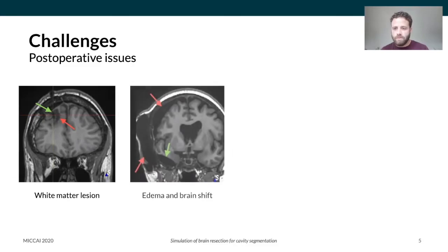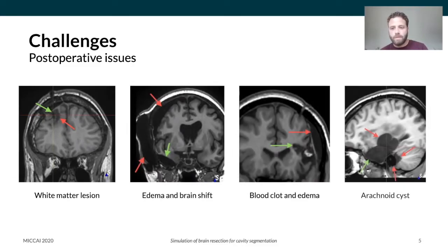Cavity segmentation is a difficult problem due to the variability in shape and texture of the cavities and to the different postoperative phenomena that make some parts of the image unexpectedly dark and unrelated to the cavity. It is also not trivial to compare the pre- and postoperative images using registration due to the missing correspondences and nonlinear deformations.